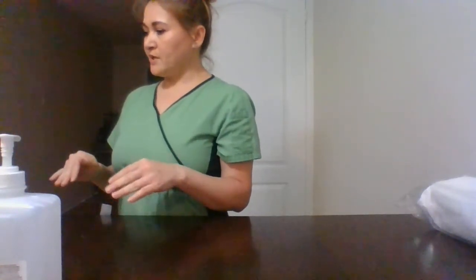Okay, perfect. So, Mrs. Jones, we will do a quick abdominal examination to make sure that you don't have any abdominal distension or to see if you have any abdominal pain. Okay? Okay, so I did a quick abdominal assessment. Now we can work on our sterile field.